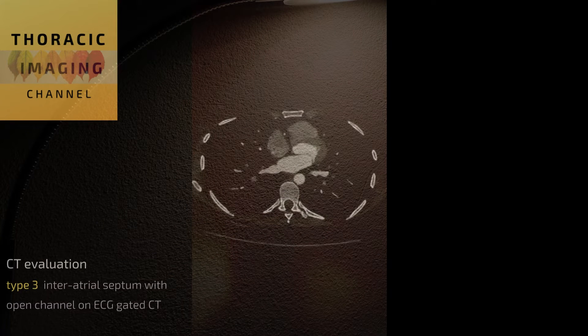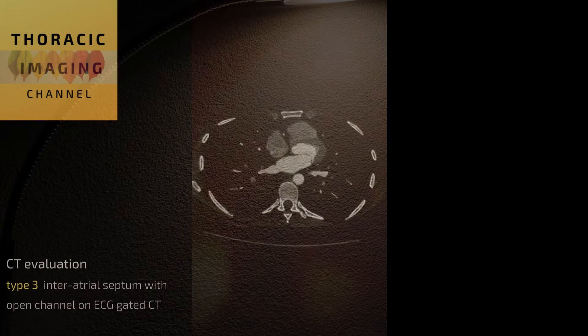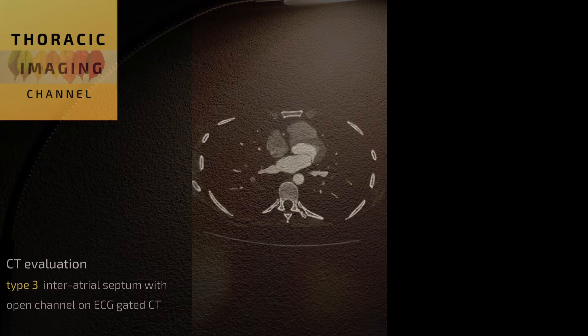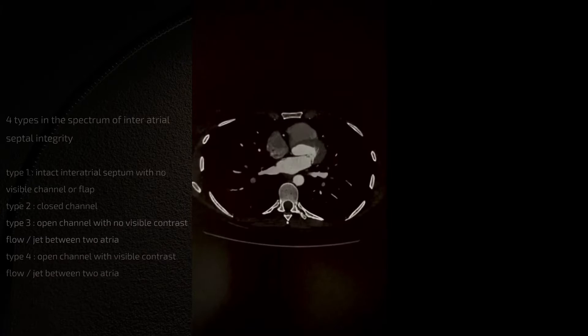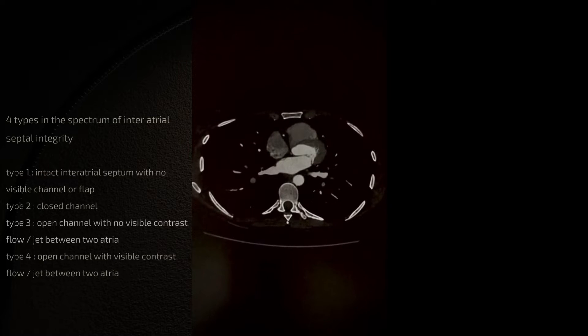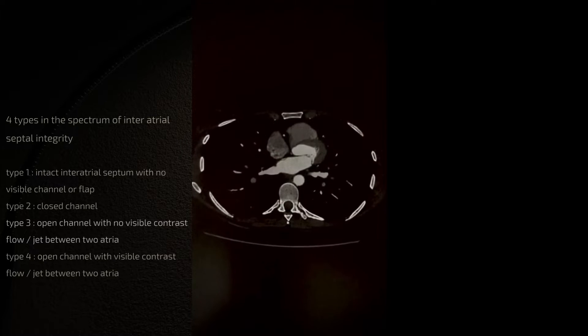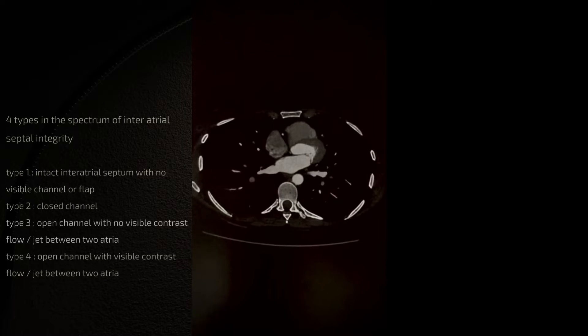In this video we're going to analyze a type 3 morphology in terms of the inter-atrial septum where there is a channel-like appearance but without distinct visible jet on an ECG gated scan.